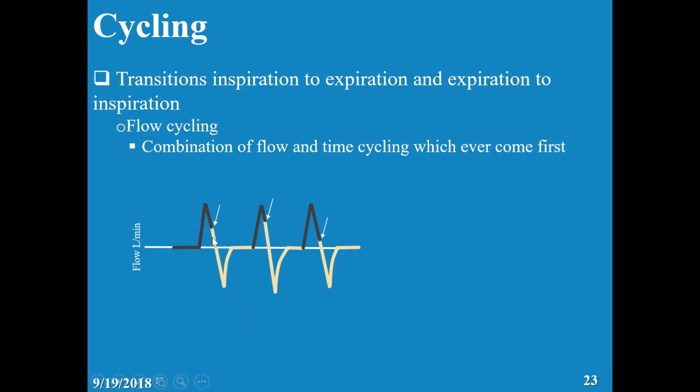So you can see here, it only supports the baby by 50%. Here, it supports the baby by 75%. And here, only 5%. So it's always measured. Here is 50%, then it gave more, then gave less. So it always measures the previous cycle and helps the baby with the next cycle.